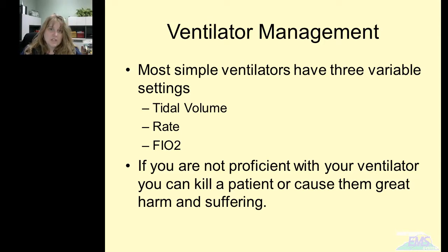Most simple ventilators have 3 variable settings. You can set the tidal volume for your patient, the rate, and then the fraction of inspired oxygen. But it's very important to be very comfortable with your ventilators, or have someone with you who can make you comfortable with the ventilators, because if you're not proficient with those skills, you can kill a patient and cause them great harm and suffering. So it's very important to understand that ventilator and know what you're doing with it.